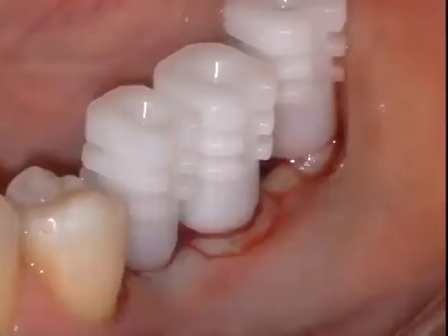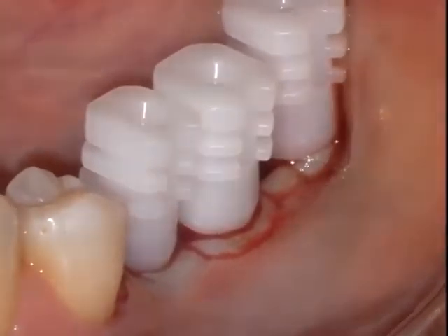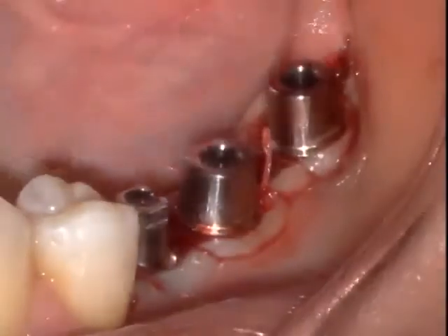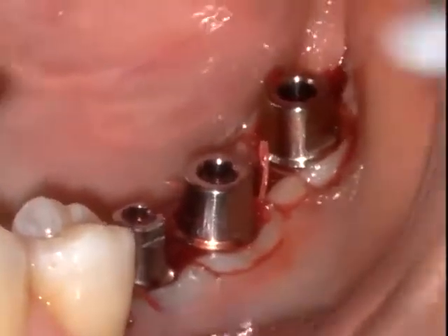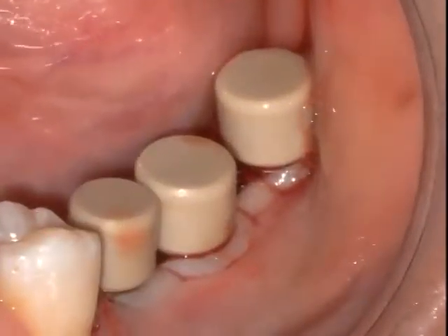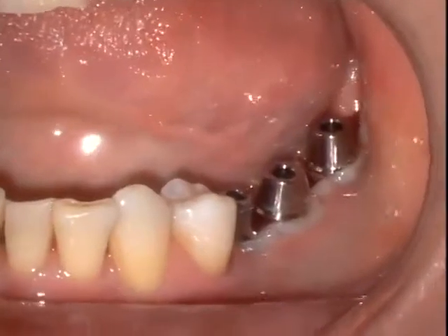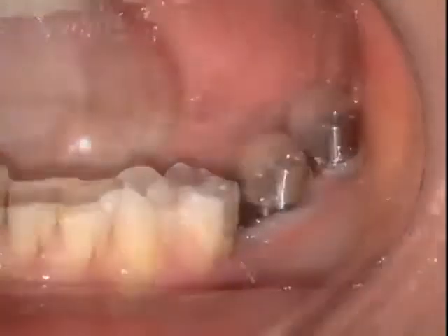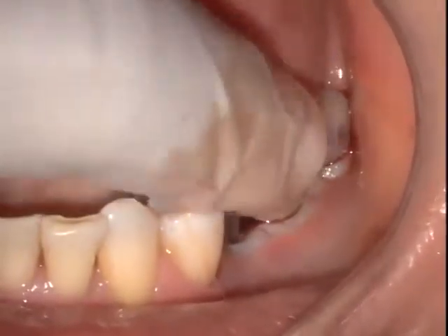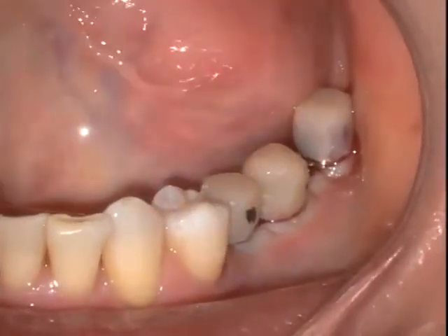We can take impressions, that snap-on impression caps can be placed and can be sent to the lab the day of surgery to be more efficient. This doesn't have to be the only opportunity. Other options are available. You can simply place healing caps over these abutments that will assist in keeping the tissue to the buccal.